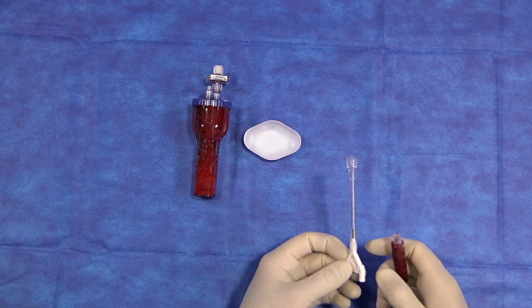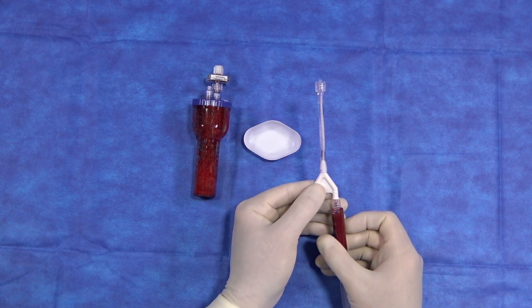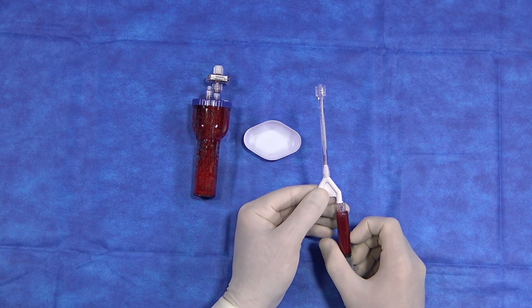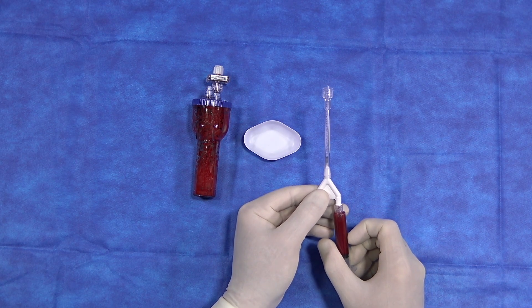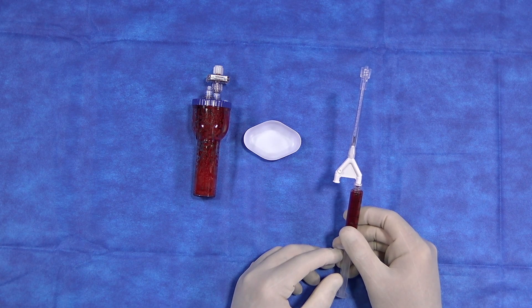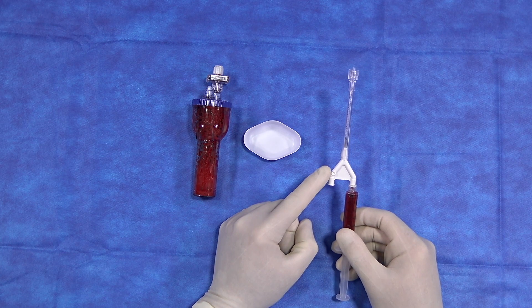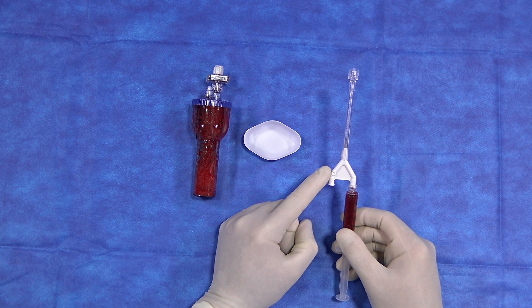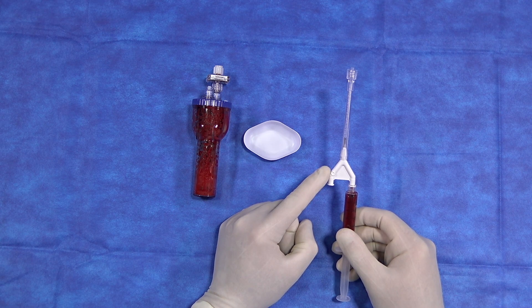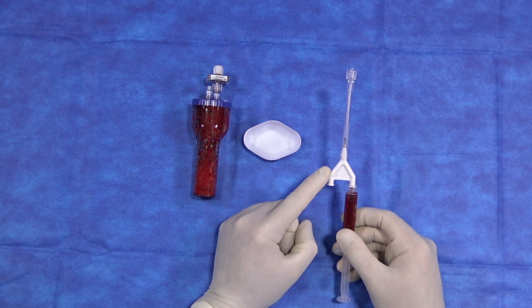We will now produce a clot using serum produced by the thrombinator system by mixing with whole blood. You will need a one-to-one ratio applicator. First, we attach our serum, noting which side the circle is on the applicator. You always want to use this port for the same material — so if you inject whole blood on this side, you will want to make subsequent injections of whole blood through the same port.